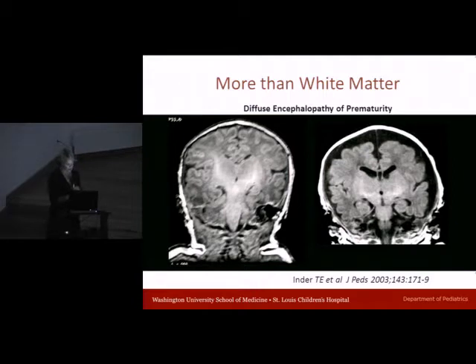So how do we capture that? Well, we noticed a long time ago, nearly a decade now, when two babies came to the scanner on the same day. They were both born at 27 weeks, believe it or not. Their parents were so excited because all of their cranial ultrasounds had been reported to them as normal. And we scanned these two babies and we were like, you know, this one doesn't look like the other. But what is this? What has happened here? Why does this baby have a beautiful brain that fills the skull with these beautiful posterior limbs and white matter volume, and this baby just looks like someone really sort of left something out?